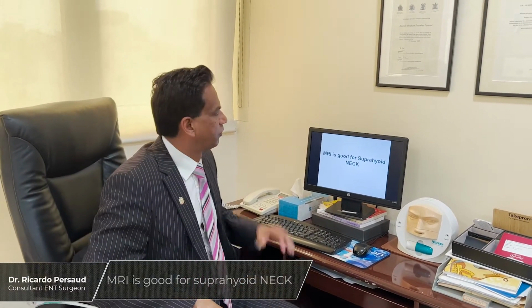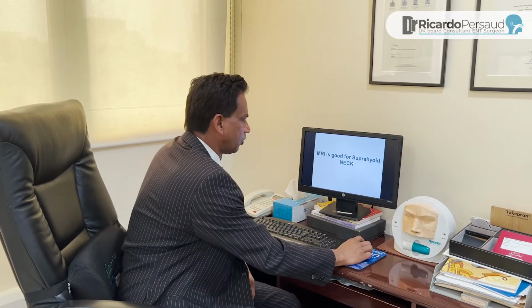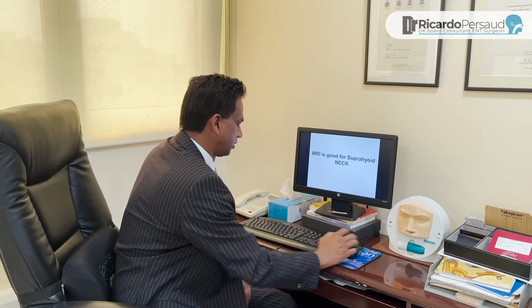In terms of imaging the soft tissue in the head and neck area, for the suprahyoid neck, which is the area above the hyoid bone, i.e. from here going up, the MRI scan is the best modality to use in contrast to a CT scan, especially for the soft tissue. So I'm going to go through one section.